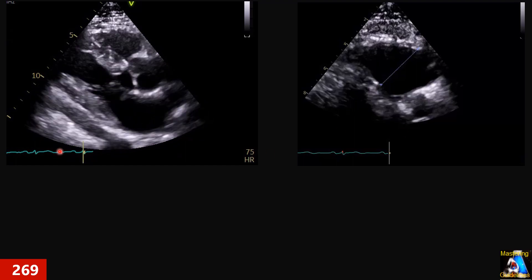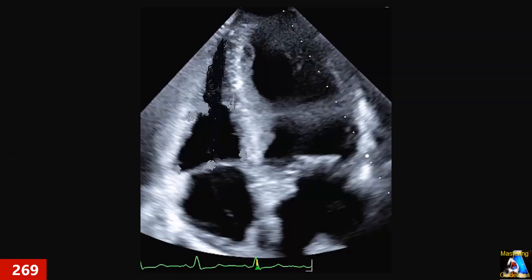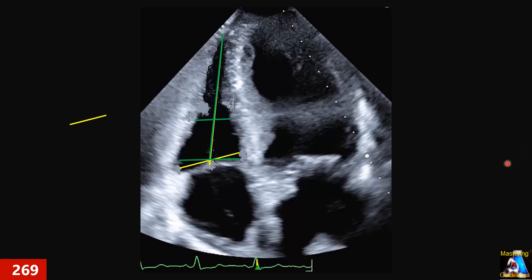Here we have apical 4, acquired in the diastolic phase. Now we are going to measure the dimensions of the right ventricle. Which of these two techniques is correct for measurement — the green one or the yellow one? Now let's go for the explanation.